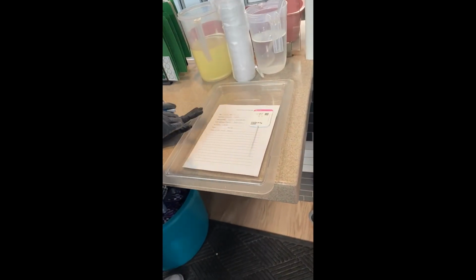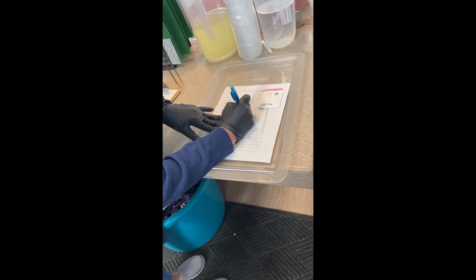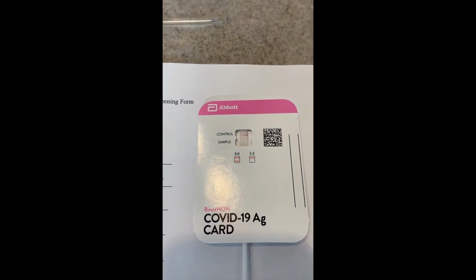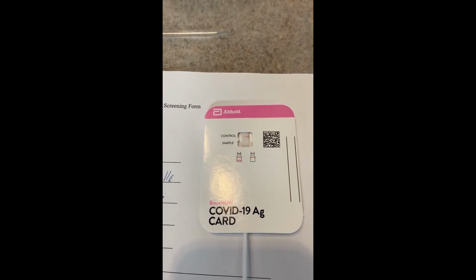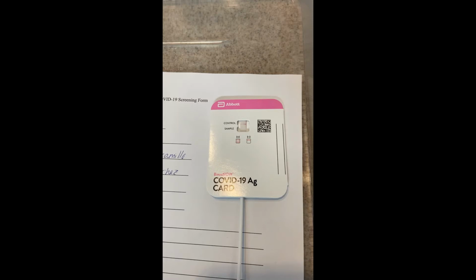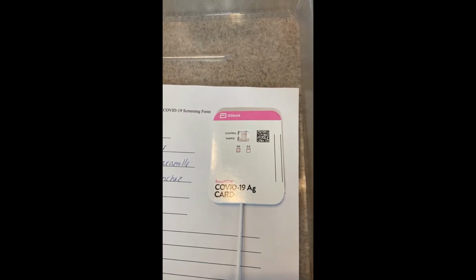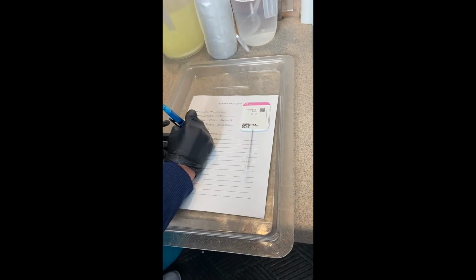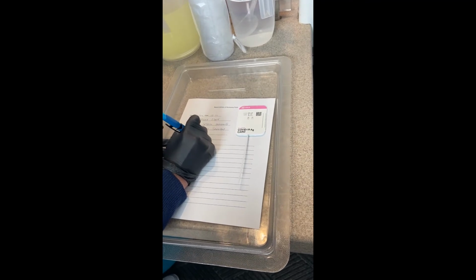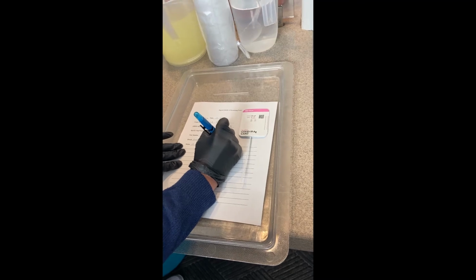Test result negative. So at exactly 15 minutes, the test result will be read. If you look into the well of the test, one line for control means that the test is accurate, and no line under sample means that the test is negative. If you see a line under sample, even if it is a faint line, that is considered a positive test. So negative result will be documented on the rapid COVID screening form, and the test will be discarded into the biohazard bin.